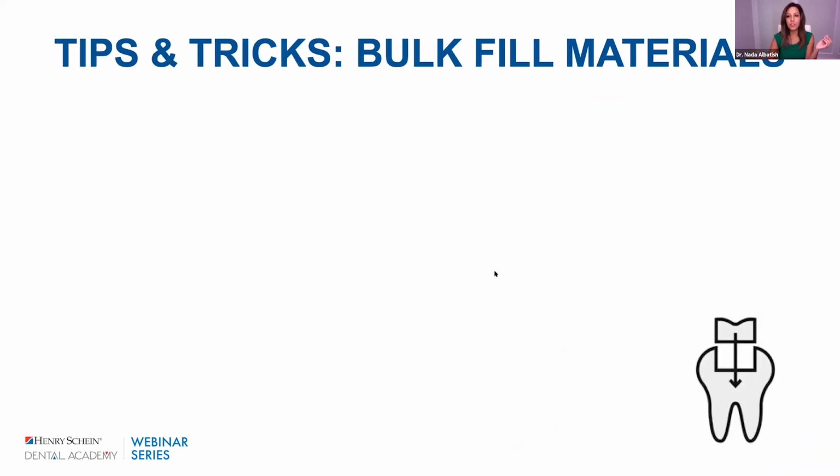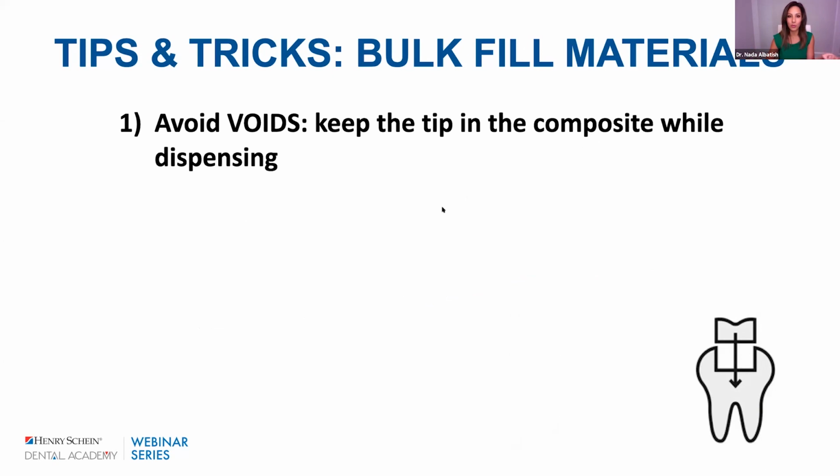So here's some tips and tricks I want to talk you through for using these bulk fill materials so that you can be successful, because everything we do in direct restorative dentistry has techniques. And once you get experience with using it, you really learn that you've got these little tricks that maybe when you started out, you didn't know. So I want to share my tips and tricks with you. So the first trick is you want to avoid voids, right? One of the biggest issues with composites is the incorporation of air bubbles at any level, right?